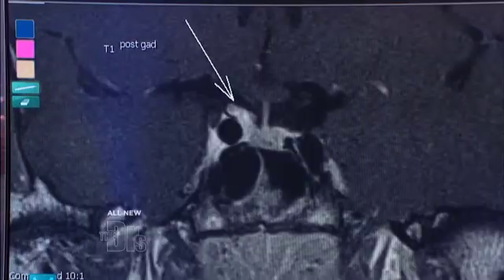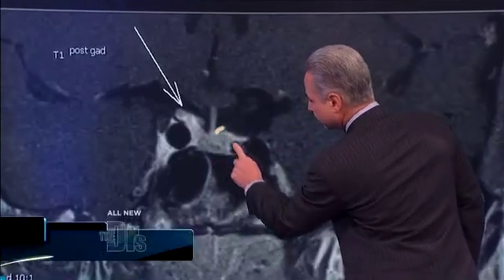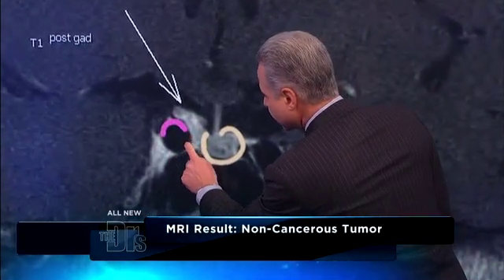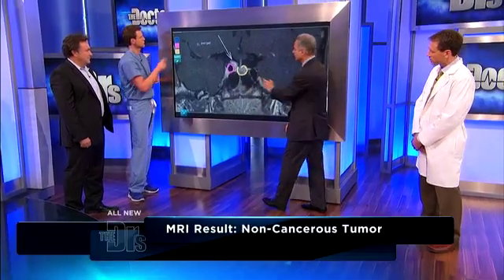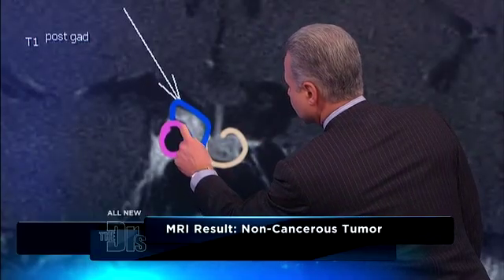Dr. Shannon, you're a skull base expert — where the pituitary gland lives. When you're looking at this, what do you see: concerning or not concerning? Fortunately, in this case — in Brandon's case — and I congratulate you, this is a benign lesion. I'll draw it: this is the normal pituitary gland here in yellow. This is the carotid artery here in pink, and there is a hockey stick lesion that you can see just between the two in blue. This hockey stick lesion is a benign overgrowth of the skull — the bone where the pituitary sits — so it is extrinsic to the pituitary.